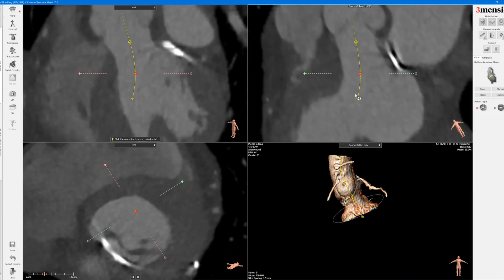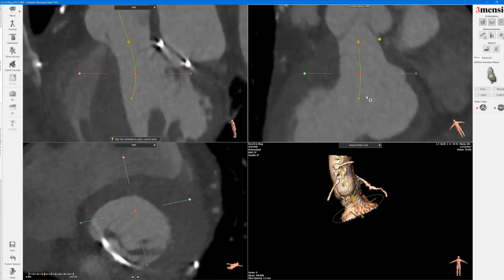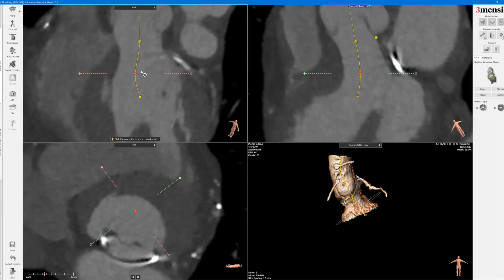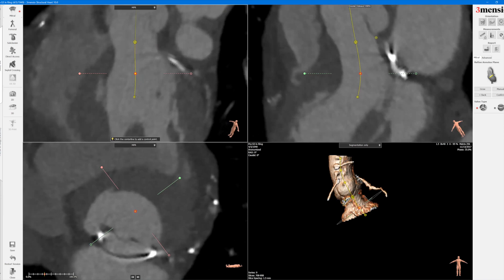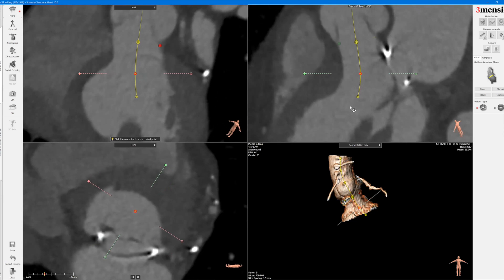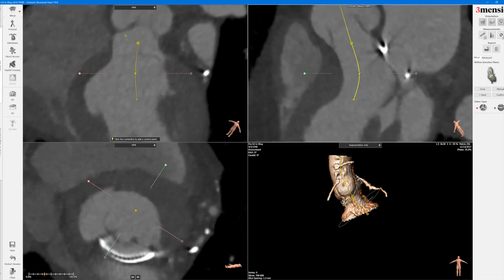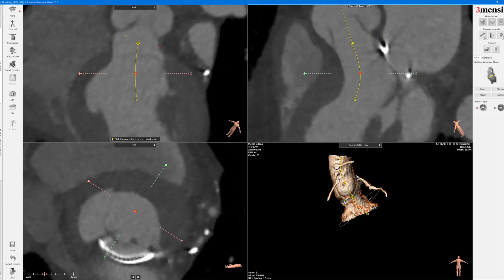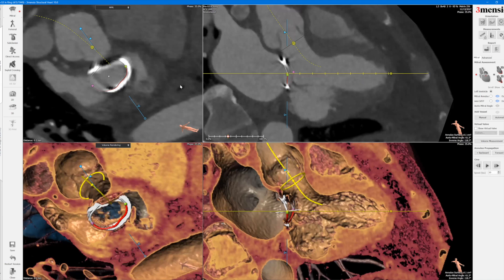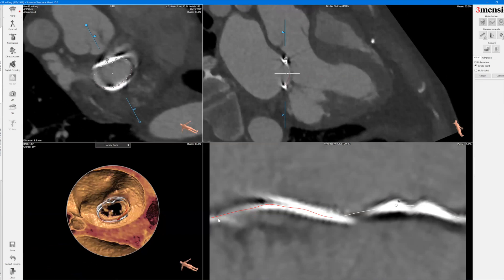You can see here that this patient has a very dilated LV cavity, which makes it a little easier to do the centerline. Once you have that, you click confirm and now you go to refine your annuloplasty ring.